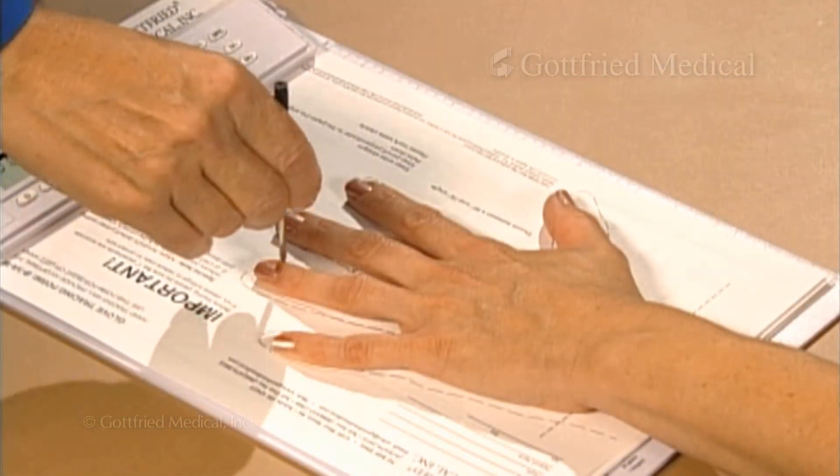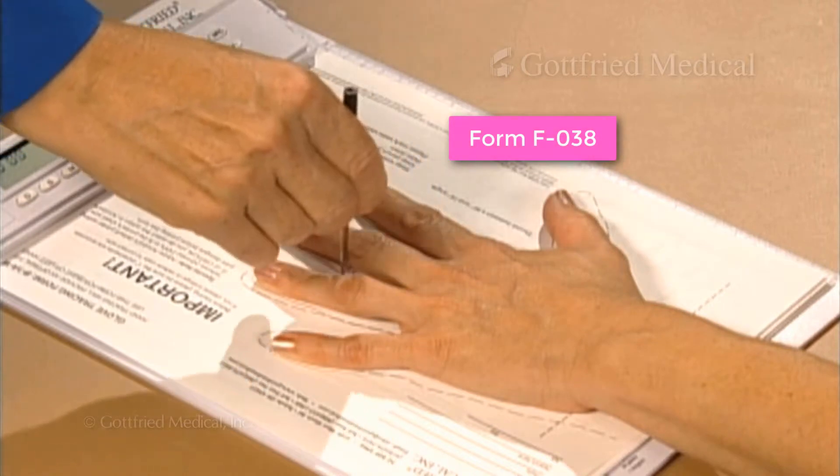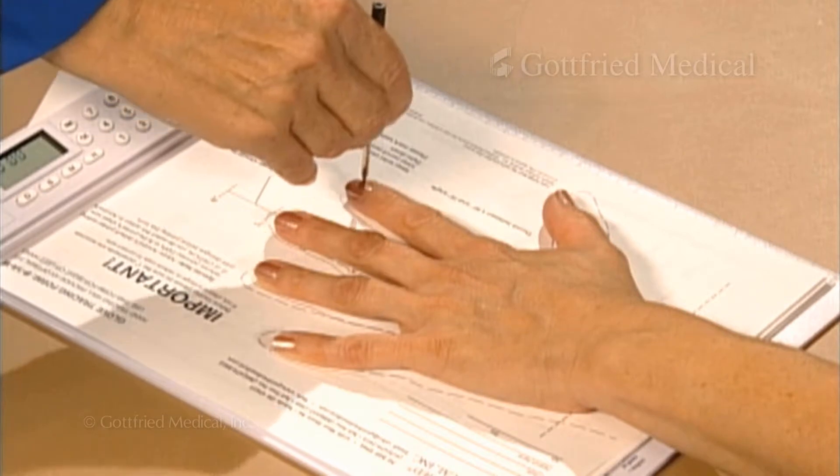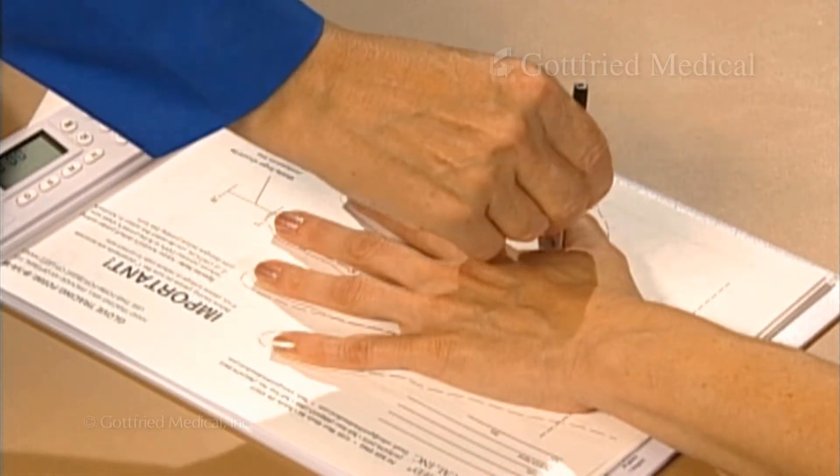Start by tracing the hand on the glove tracing form, making sure to keep the pen or pencil perpendicular. This will be used to obtain length measurements and will be recorded on Form B1W.